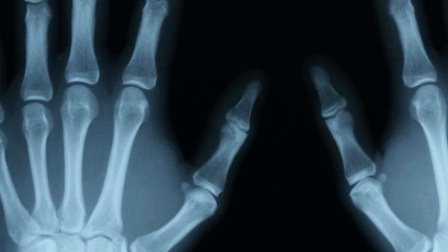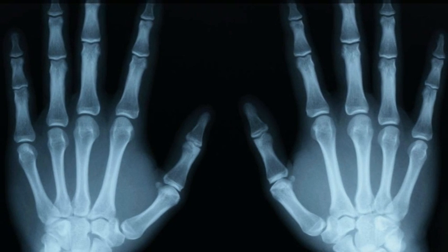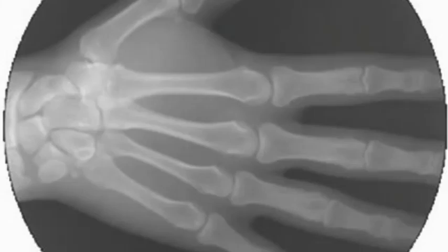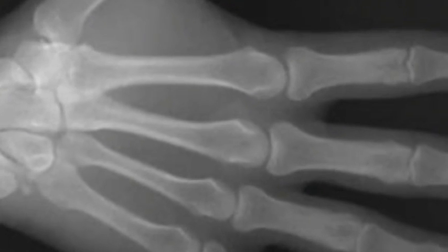A series of gifs created by designer and developer Cameron Drake, in collaboration with orthopedic surgeon Dr. Noah Weiss, showcases some of these motions. Dr. Weiss conceived the idea and took the x-ray footage, which can be seen on his YouTube channel, and Drake converted them into gifs for Dr. Weiss' website.